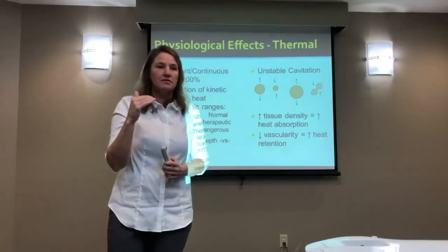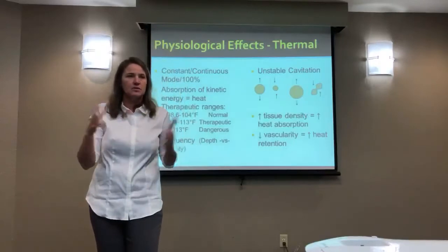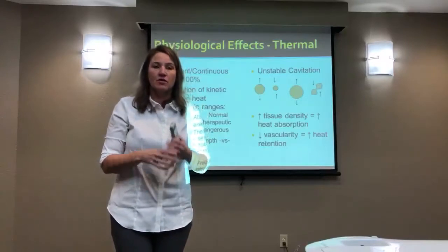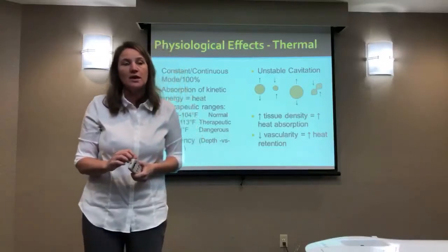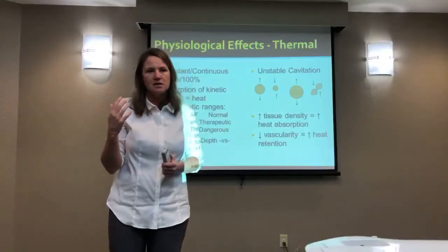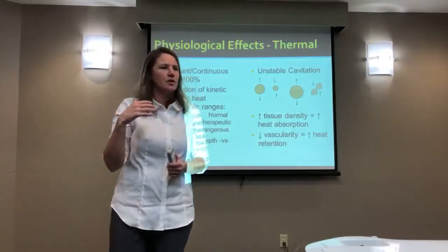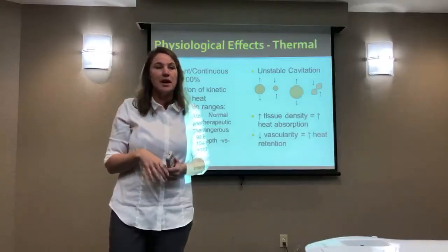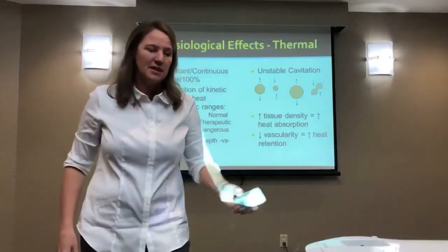increasing the ability of stretching the tissue. So the tissue becomes more able to stretch, and that's what I'm looking for. It has the ability to stretch, be more flexible, and have more permanent stretches without soreness. So a lot of times if you want to heat and stretch a tissue, you're going to want to go into those upper ranges. That's simply based on research that shows lower therapeutic ranges are good for blood flow and metabolism. The higher you go, the more potential for that tissue to be pliable and increase the plastic effect of stretching. Beyond 113 becomes dangerous.